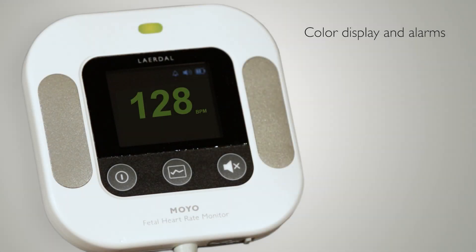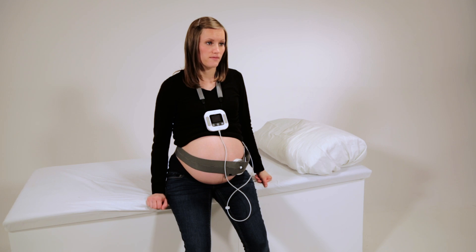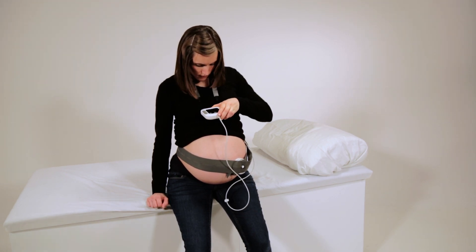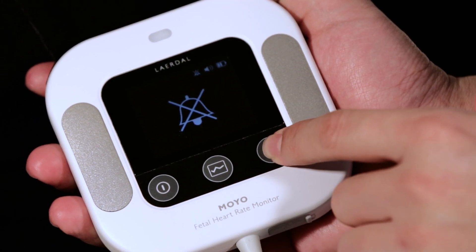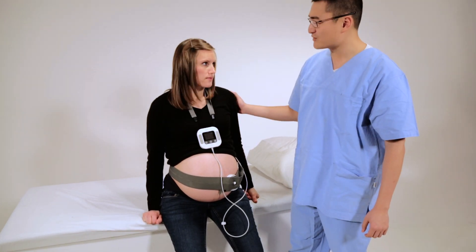The color of the numbers on the display indicates whether the fetal heart rate is normal, abnormal, or has been abnormal for a prolonged period of time. In the case of prolonged abnormal fetal heart rate, Moyo will sound an alarm. The status light and numbers will be displayed in red. Follow guidelines for correct and timely obstetric responses.